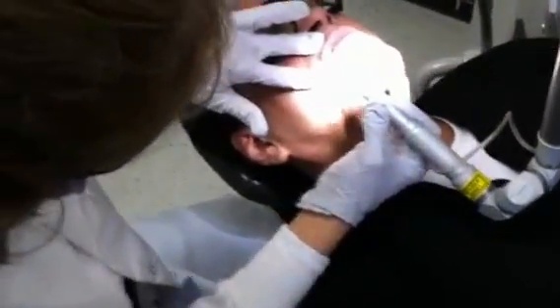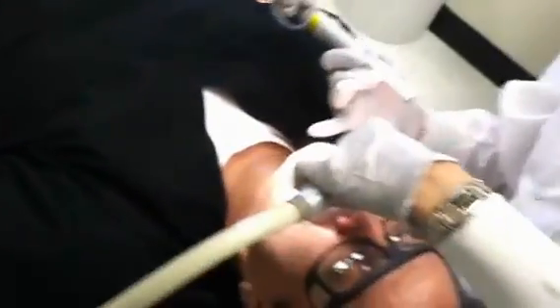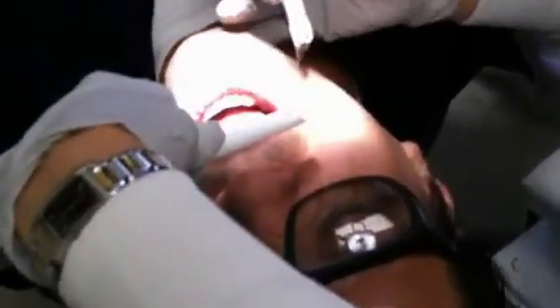I'm going to come in kind of from far away, and you're going to feel a little warmth, Nick, okay? And then just tell me, and I'll back off a little bit. I'm going to do a little suction in here, and then when it hits a little — feel that? Mm-hmm. Okay, listen a little bit, but I'll hit the bottom there.